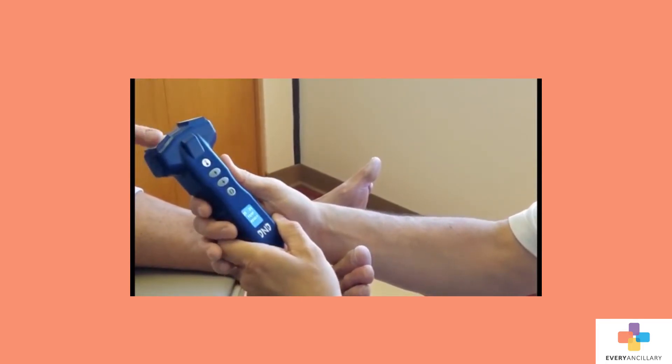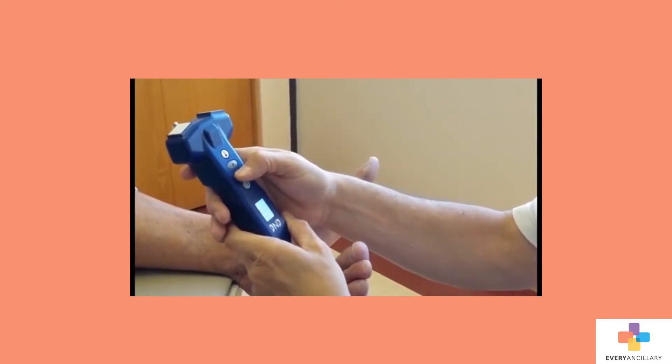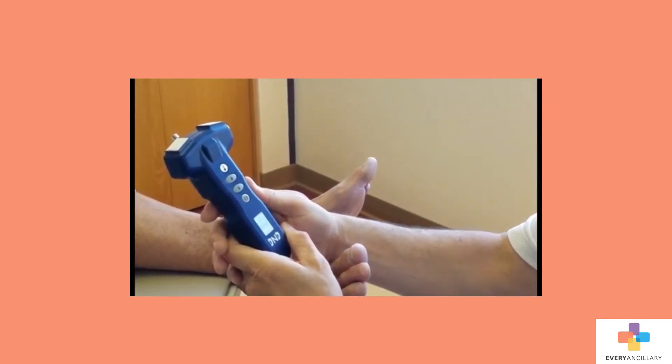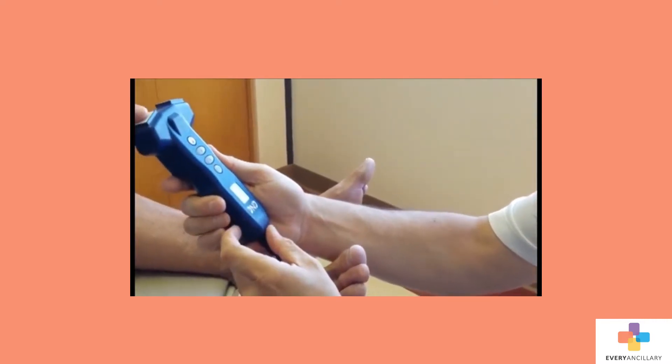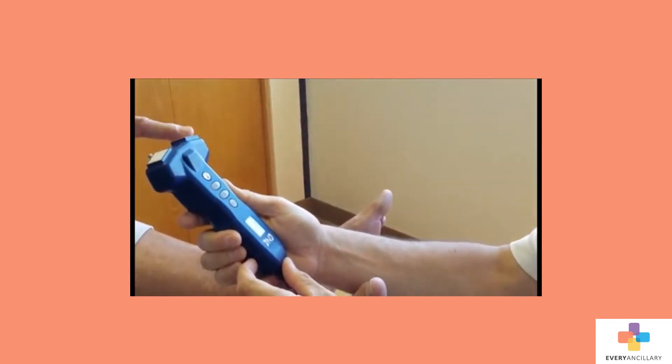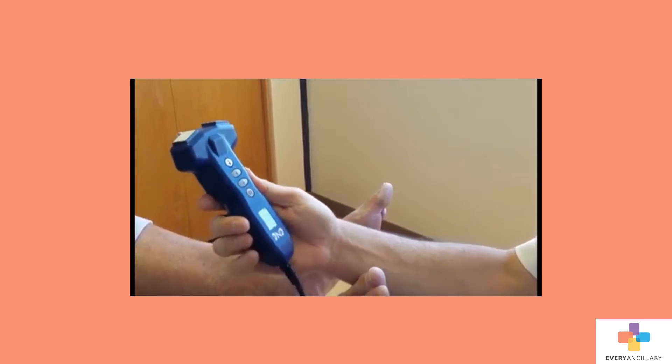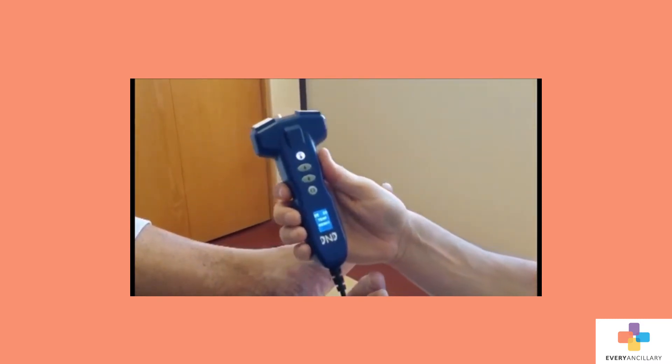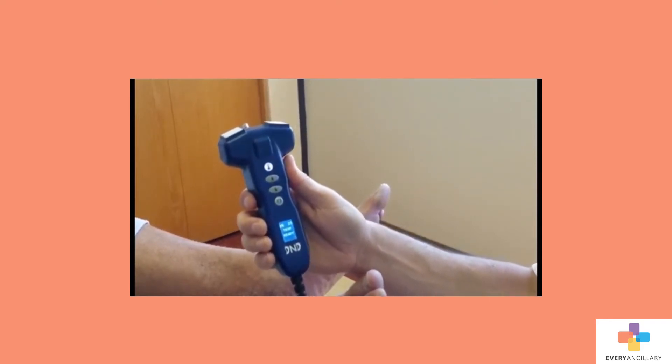Can you feel the difference? Yes, I can. The patient can discriminate 2 degrees with their fingers, but only 6 degrees with their feet, which may indicate a neuropathic condition.